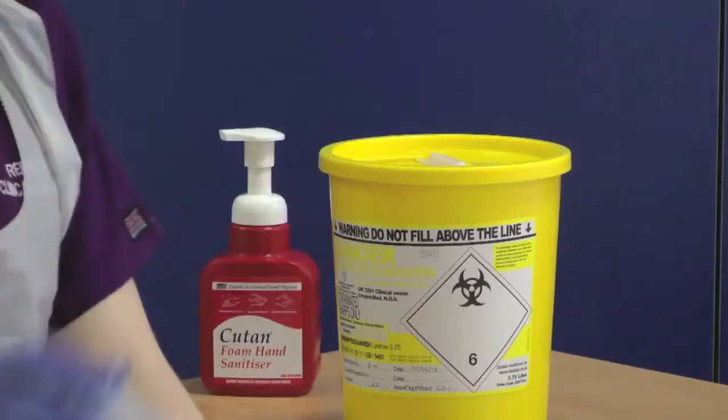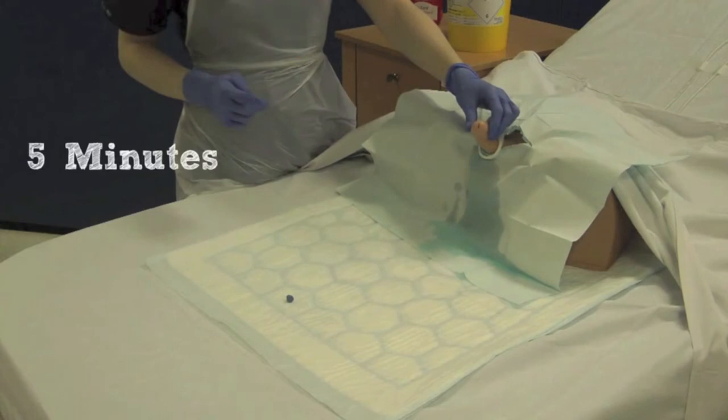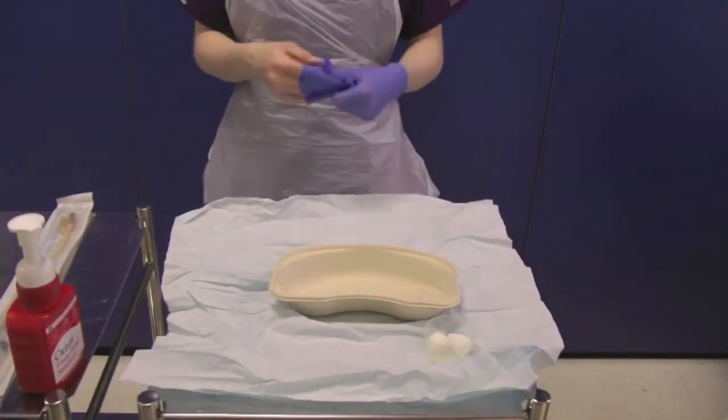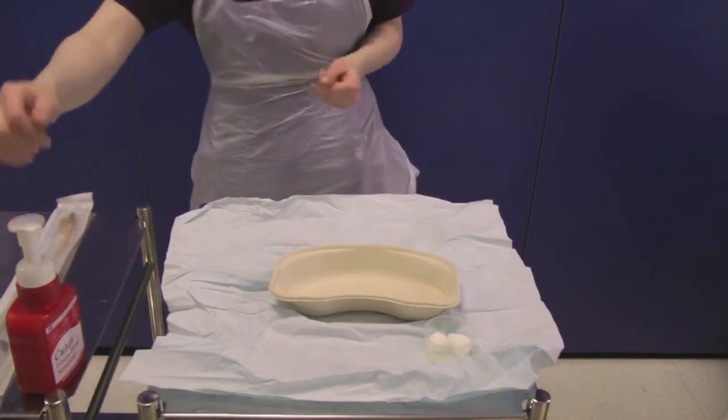Dispose of the syringe into the sharps bin. Gently squeeze the tip of the penis to prevent leakage of the gel, allowing 5 minutes for the gel to take effect. Remove your gloves and decontaminate your hands.